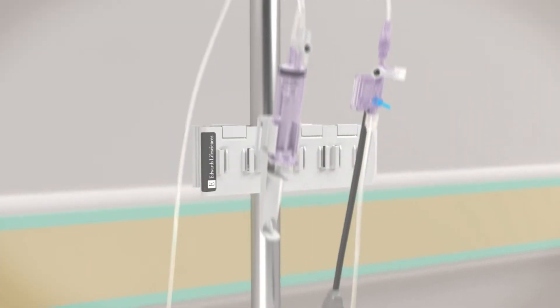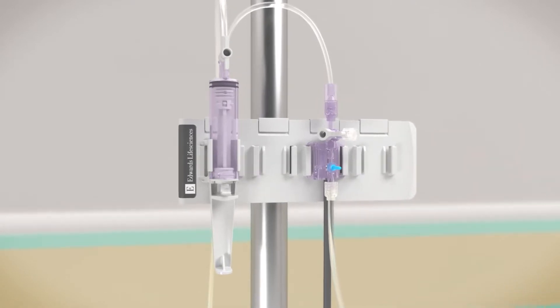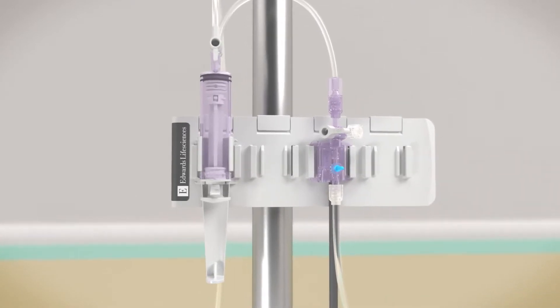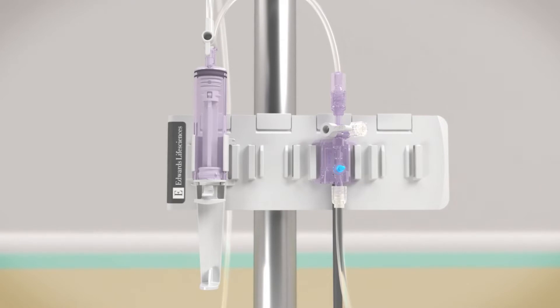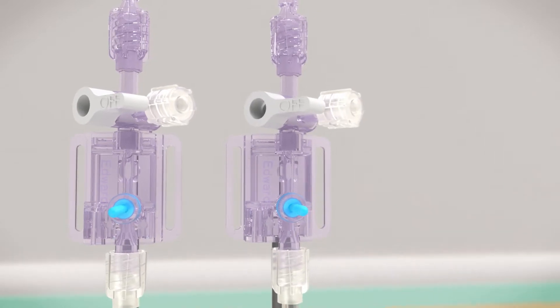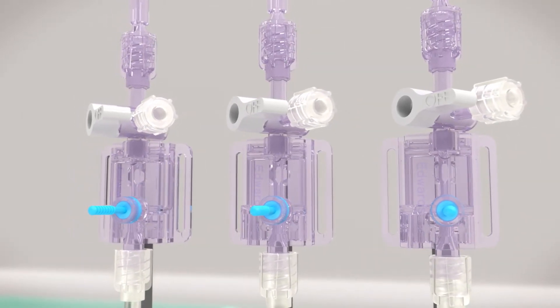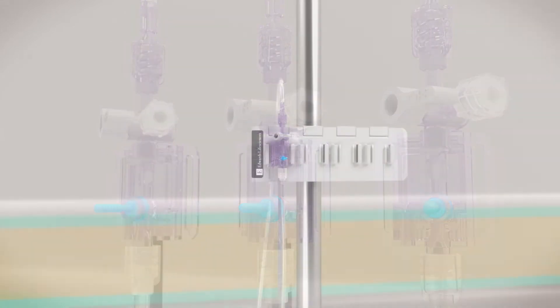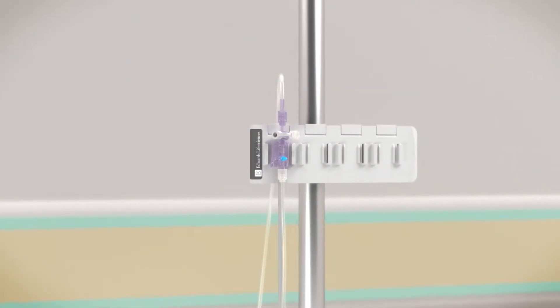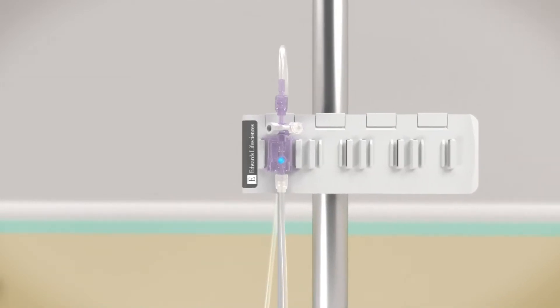TruWave disposable pressure transducers can be paired with Edwards BAMP systems to create a single integrated pressure monitoring and closed blood sampling system. TruWave transducers are available in single, bifurcated, and trifurcated forms to suit your patient needs. The following animation demonstrates best practice in the setup of a single TruWave disposable pressure transducer.